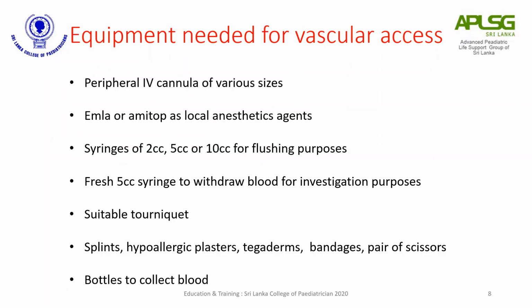As in any other procedure, the preparation is very important. So what is the equipment that is needed for vascular access? You need to have IV cannulas of various sizes. Local anesthetic agents are important too for pain relief.